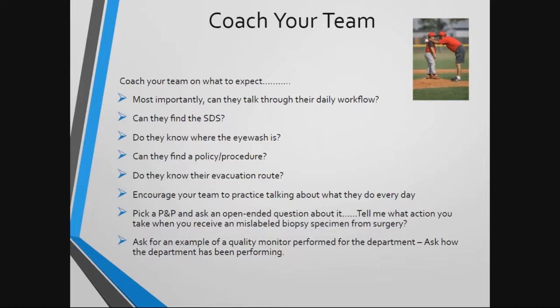Kind of related to the last two bullets, there have been many times where we've had inspectors come in and just ask our staff to produce a safety data sheet or show me any policy.